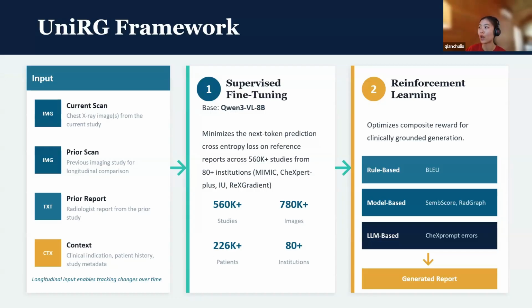And actually for BLEU, I think the finding from the paper is that BLEU correlates very poorly with the final human judgment. So here we just assign a 0 weighting for BLEU as well, in correspondence to what RadCliQ evaluation found out. But it is here just for reference. If anyone wants to use the framework to increase the weighting, you can also do that. But in theory, it's assigned a 0 weighting.